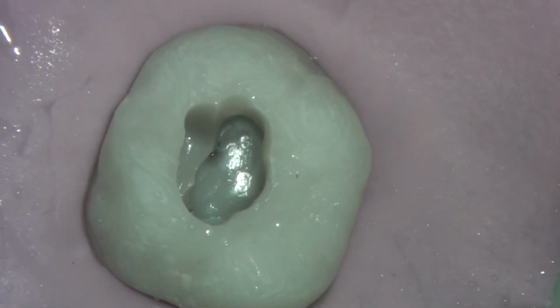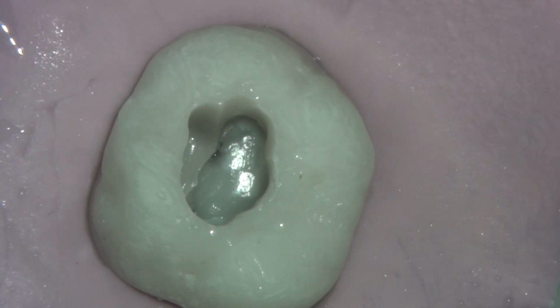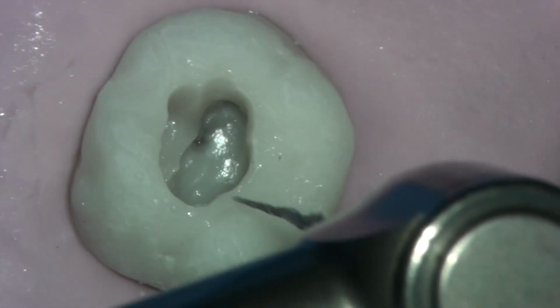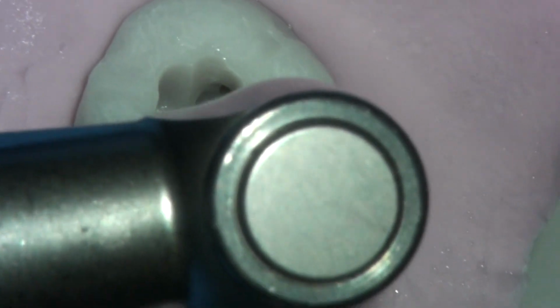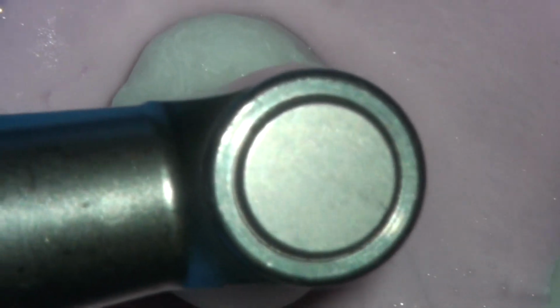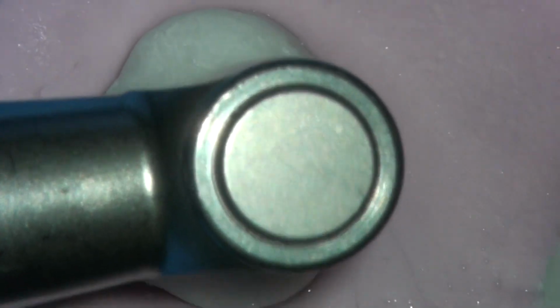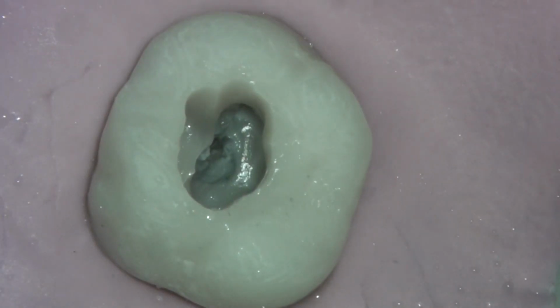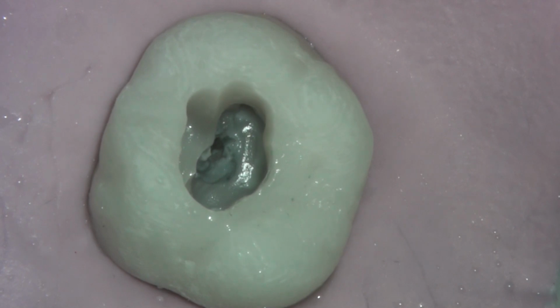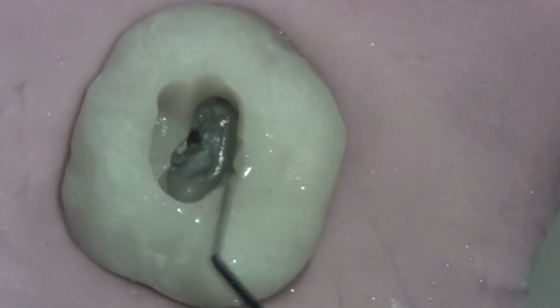At this point, we have measured our instruments to a definitive length of 21 millimeters, and we are now going to introduce this file in, and we are going to let it go to full working length. So again, in a few passes, brushing on the outstroke, brushing on the outstroke, and at that point we are happy that our first instrument has gone to length, and we can then reintroduce our irrigation needle in order to remove the dentinal debris that will create. So we go in there and we clear that out.